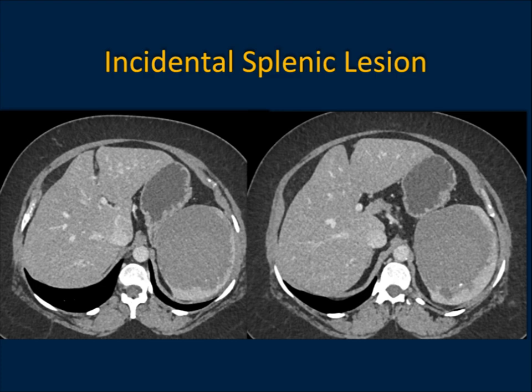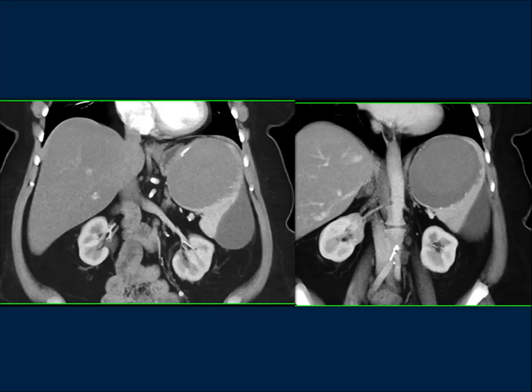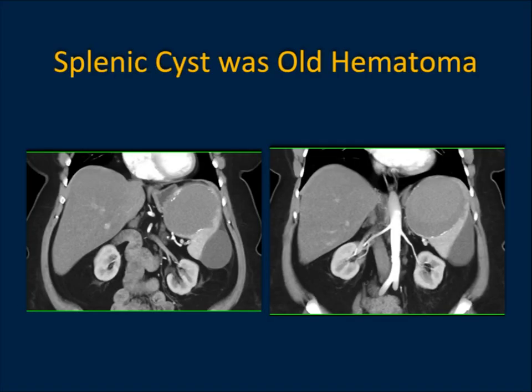Another case — incidental splenic lesion with slight irregularity of the posterior wall. You might ask: is this a complex cystic lesion? Could it be a cystic metastasis? There are subtle perfusion changes in the spleen, and that posterior wall does give concern. It still could be a cyst, and there is some calcification. Old hematomas can have calcification — sometimes dense, sometimes thin. Because the patient was symptomatic, this was resected and turned out to be an old hematoma. So cystic lesions, particularly with calcification, should always prompt consideration of hematoma.